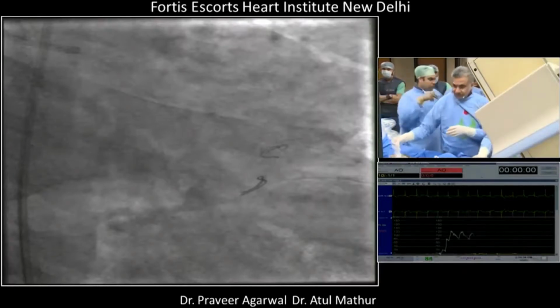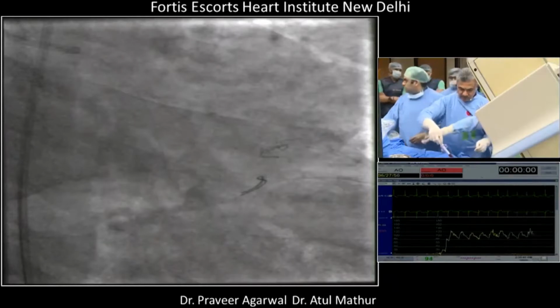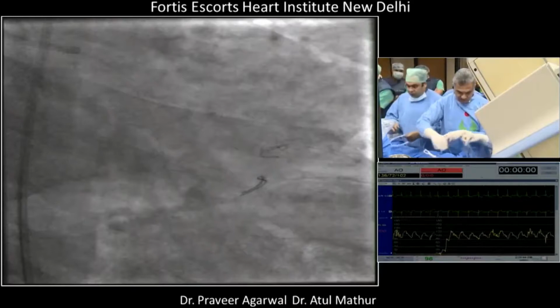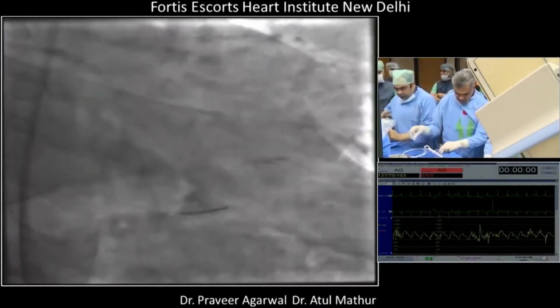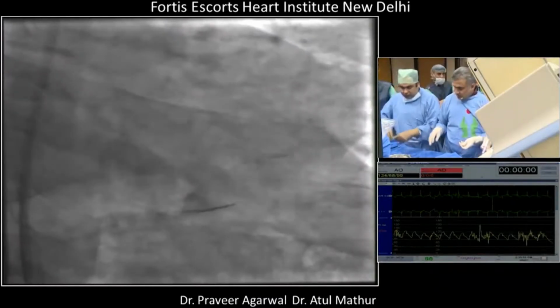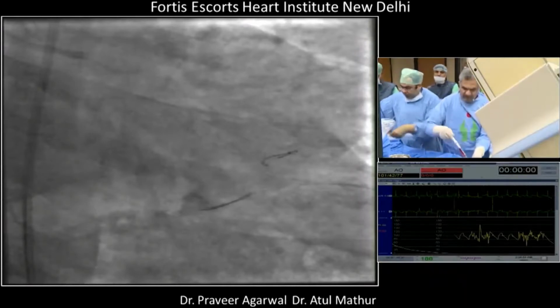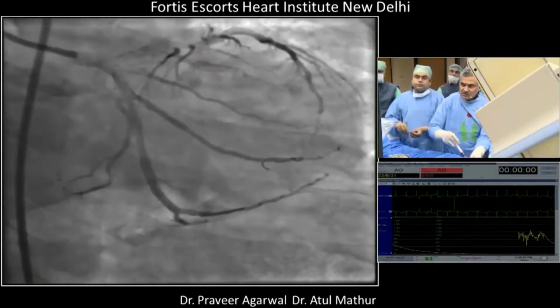I think we'll take a look at all these steps. It's very good to see DK crush. Pressures are good. I think in the morning we were discussing most people either prefer crush, but DK studies have all been shown that DK crush is better than provisional as well as better than crush, better than culotte. Okay.